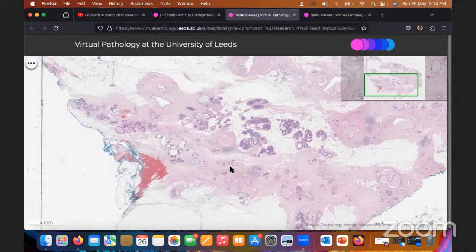So this is a kind of straightforward question, and it is a low scoring question. So as not to be moved away by the epithelial hyperplasia and in situ component, they want to see that the candidates are confident enough to denote that this is a benign entity, and they know that this is a specimen which commonly occurs in this clinical setting.